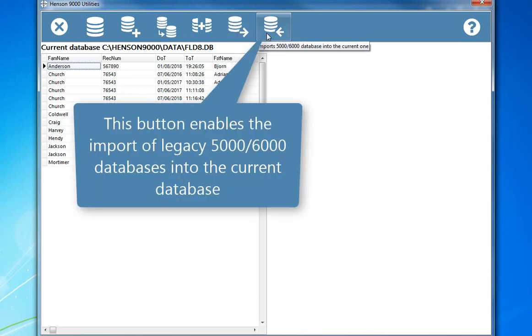And this button enables the import of legacy 5000 or 6000 databases into the current database.